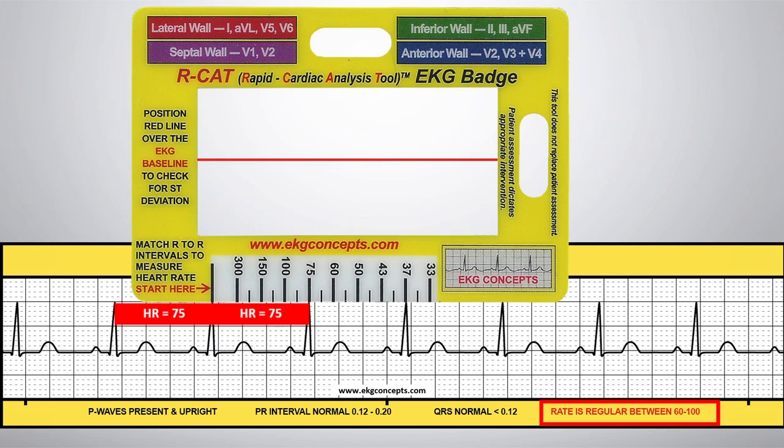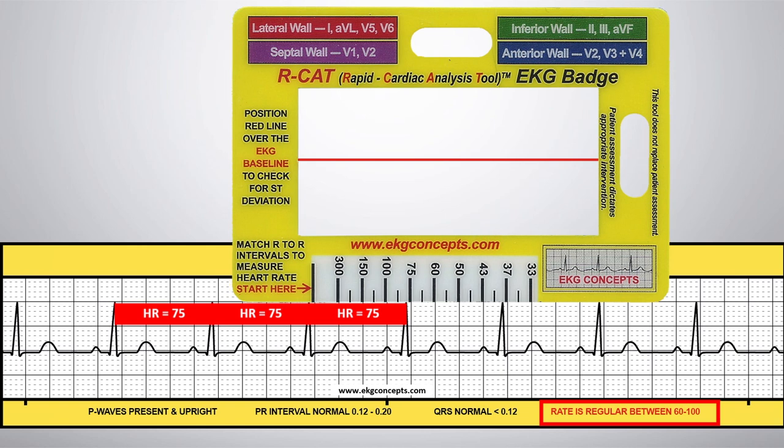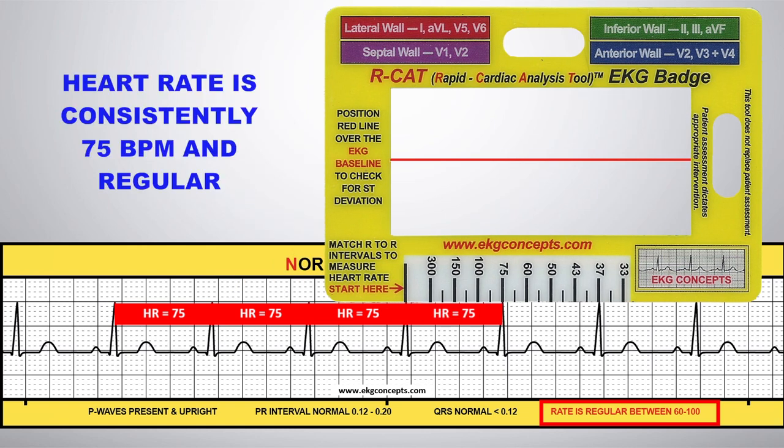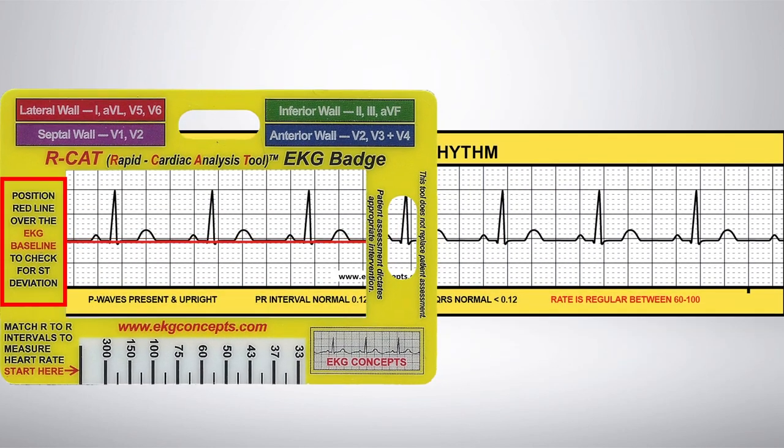Match the R to R intervals to measure the heart rate. The heart rate is consistently 75 and within the normal range of 60 to 100 beats per minute.